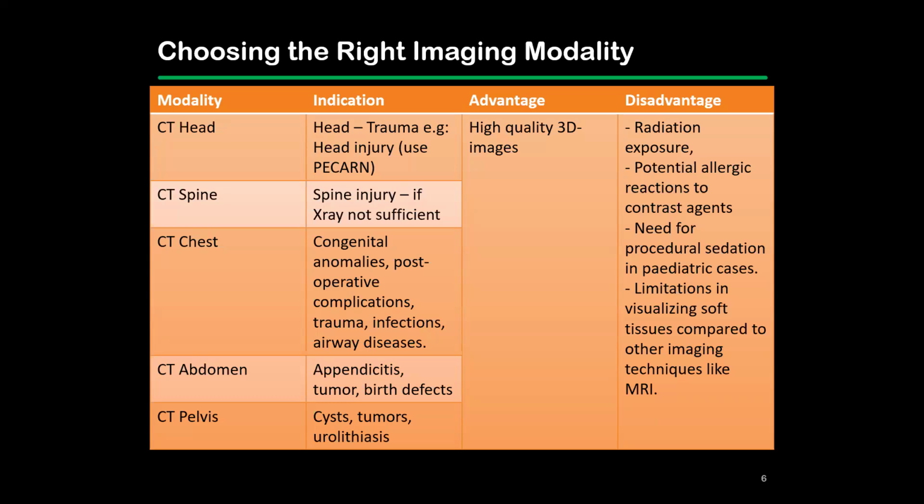And children would definitely need procedural sedation when taking a CT, because putting a child into a CT scanner is sometimes scary. So at the end of the day, they need to be sedated to minimize movements. And you do have a limitation in that you may not be able to visualize soft tissues compared to other imaging techniques, such as magnetic resonance imaging.